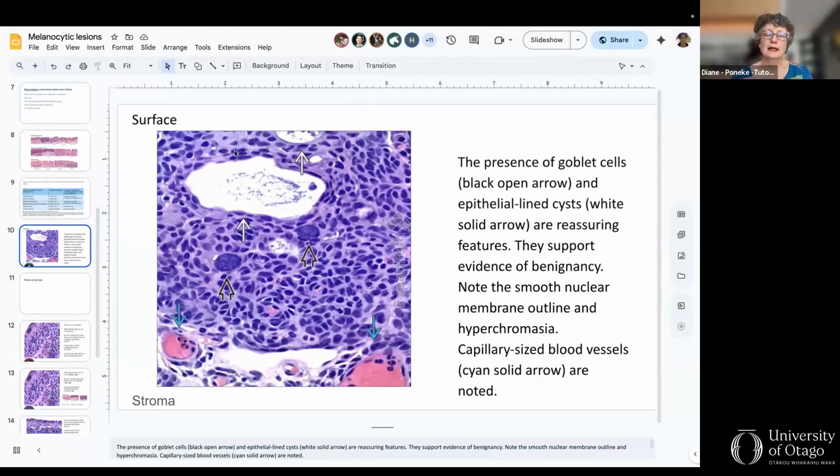And melanocytes, they love to crawl down those epithelial invaginations of the conj, the pseudoglands of Henle, and occupy them. And even though they're crawling down those glands, they are not going past the basement membrane. They are not invading. So if we see a gland in the middle, this is actually a feature that means that this melanocytic proliferation is probably still in the epithelium.